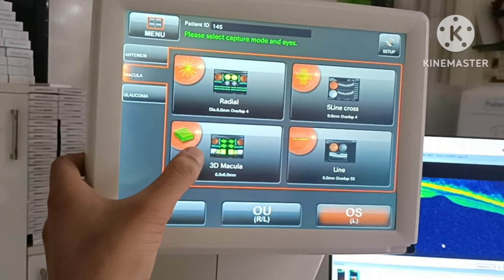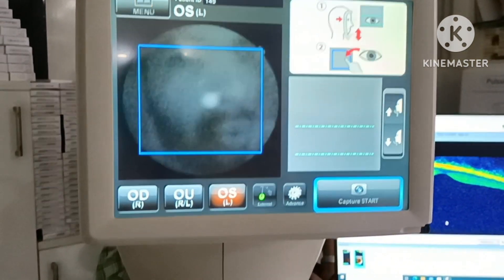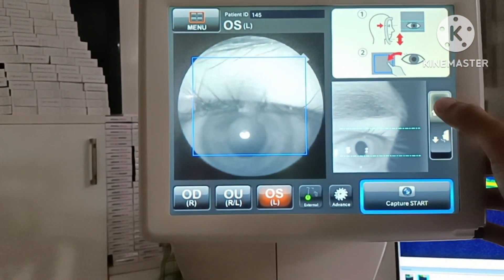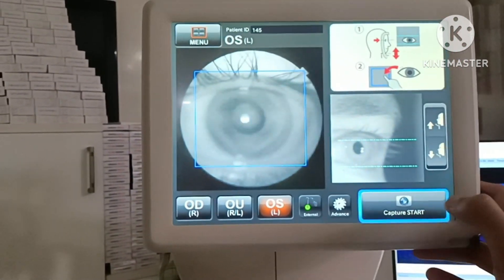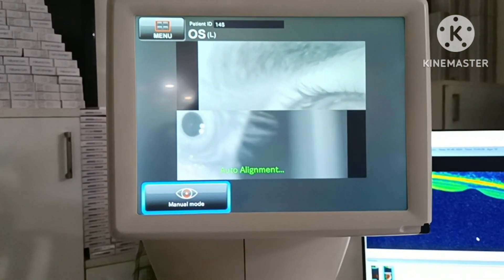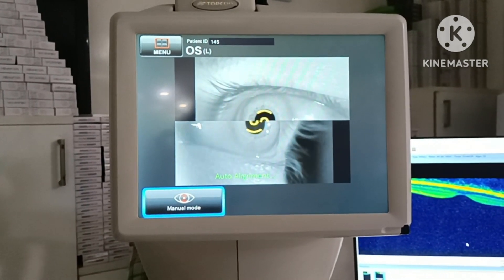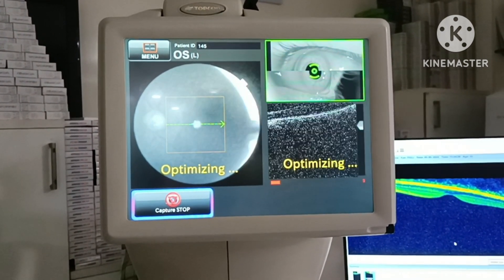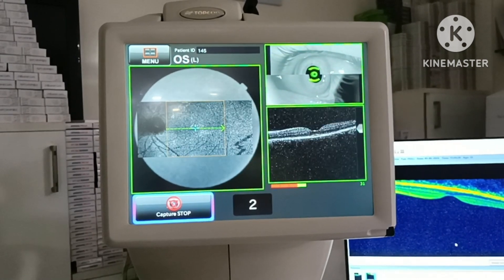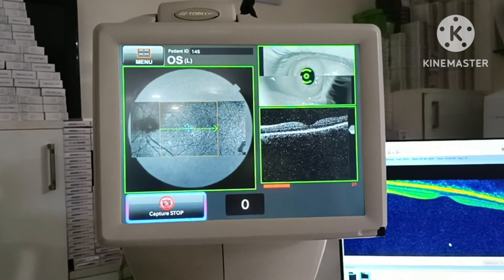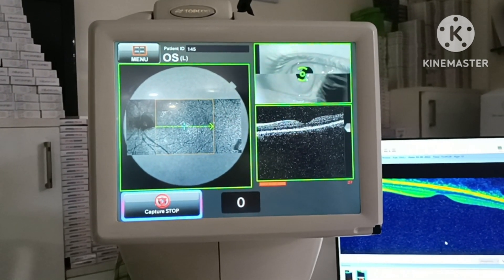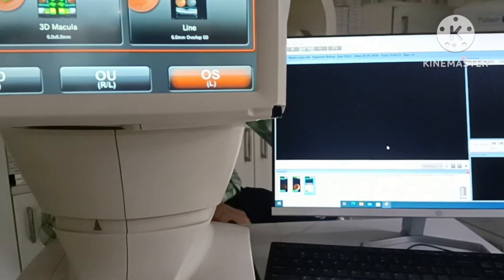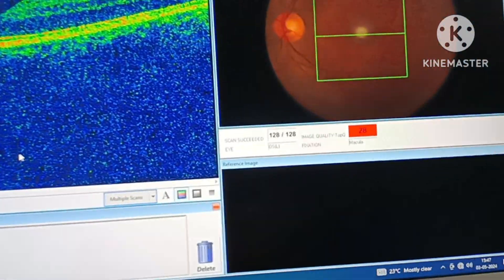Menu: 3D macula. Capture — capture on 5th. It's 28% image quality.